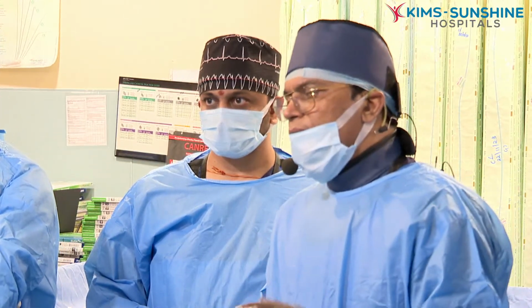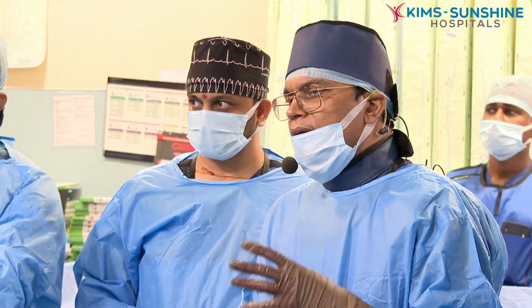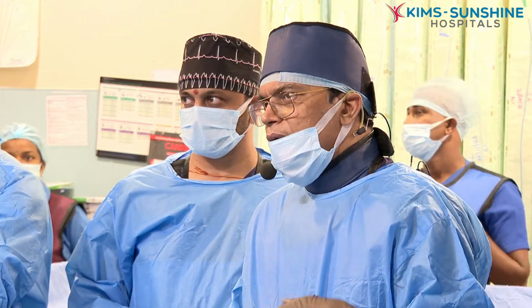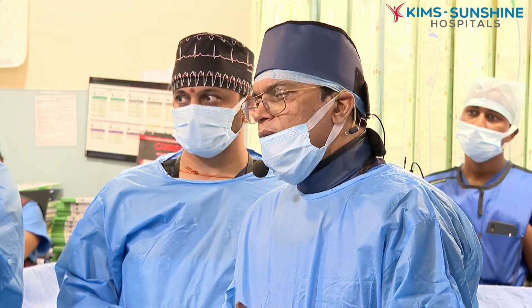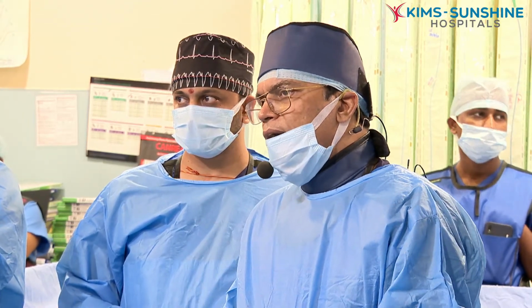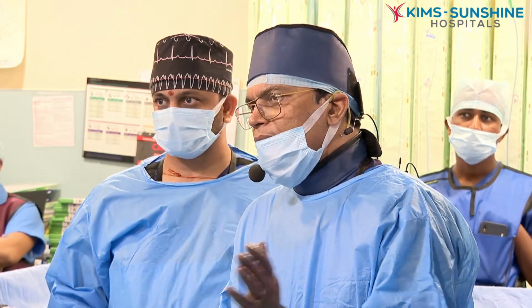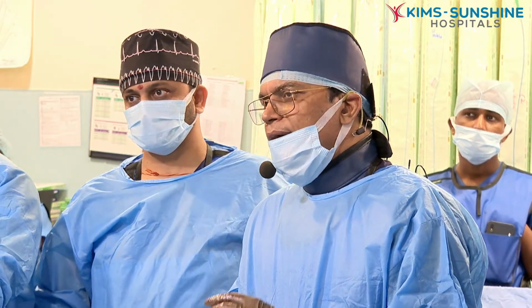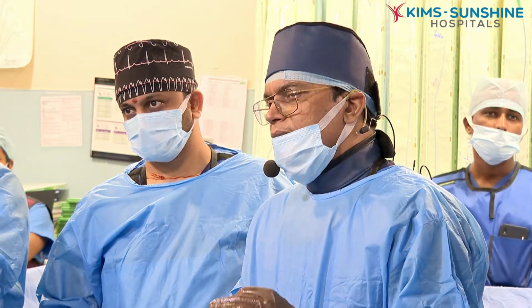Assume that you did the 1.5 ROTA bar. Still the luminal area is not gained, and still the calcium thickness is more, and you are still unable to see fractures, then you go to a 1.75 or 2 mm bar, or else you can go to IVL or use the orbital. Ideally you can combine ROTA with IVL or orbital with IVL, particularly when very severe, thickly calcified lesions are there in such cases.